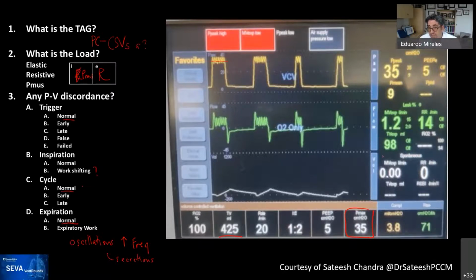And it turns out the tidal volume is super petite. So I don't know if this is a little baby and the amount of variation that we're seeing on the monitor is just the sensitivity or the gain on the screen. It's too sensitive. I don't know, Rob.